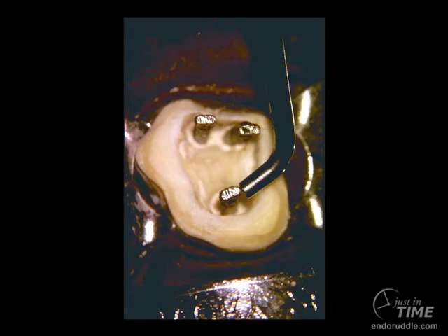This is an older version of the ProUltra 1; the newer version transfers about 30% more energy. We'll vibrate on this post up and down its length and around it circumferentially for up to ten minutes. If the post isn't coming out in ten minutes, we need to think of another alternative approach.